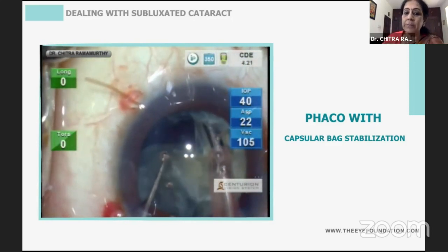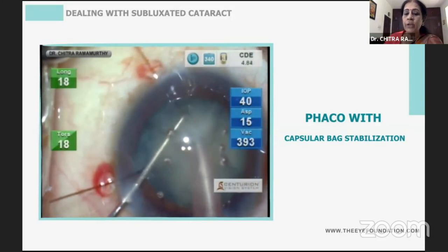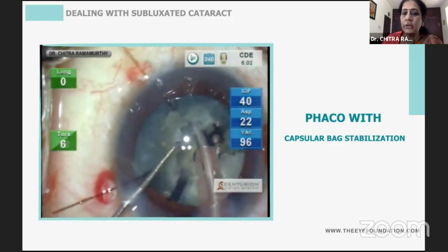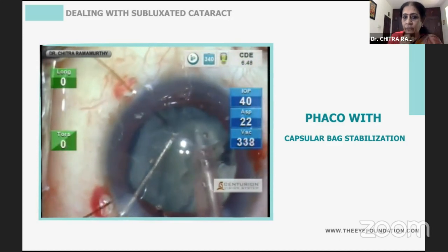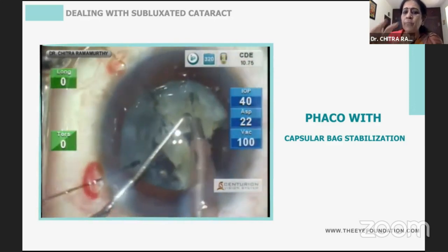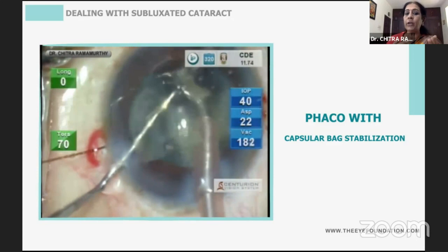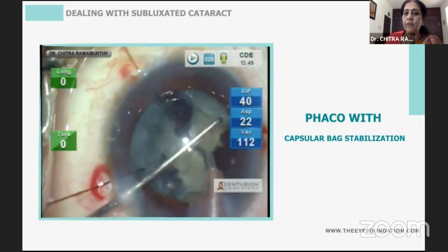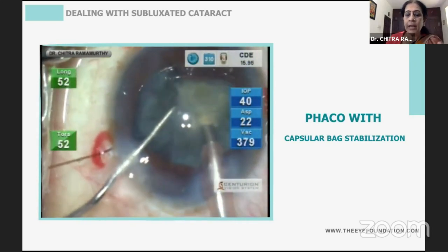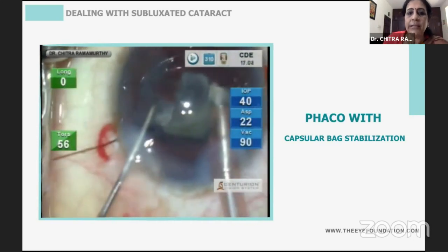One major advantage is that while nuclear fragments are present, they keep the posterior capsule well away, because a lax capsule can trampoline into the phaco probe. While the pieces are there, you're better off as long as you do not stress the capsular bag, inject enough viscoelastic, and do not shallow the anterior chamber. When you get the first fragment, bring it immediately into the supracapsular space. As you approach the end, the bag gets lax, so reduce vacuum parameters and be extremely cautious, doing supracapsular phacoemulsification for the last piece.